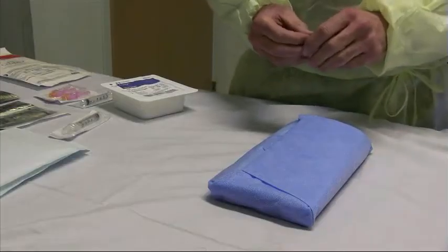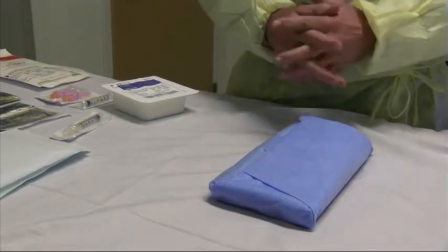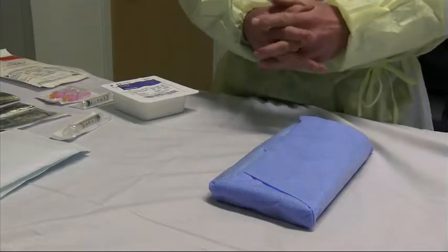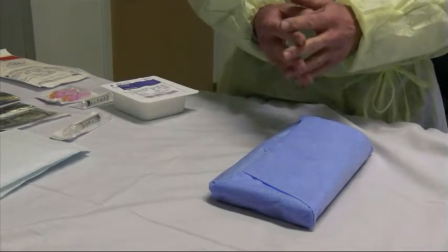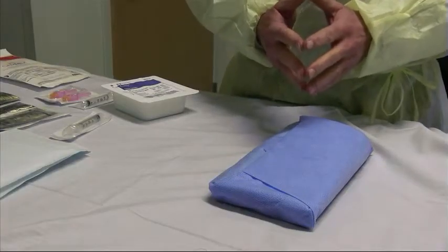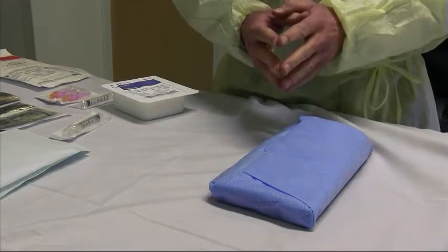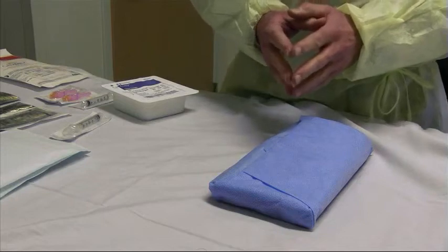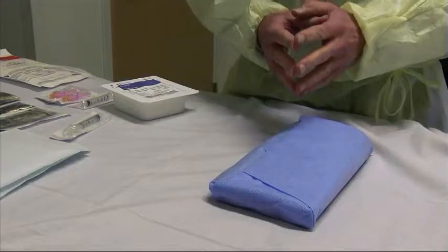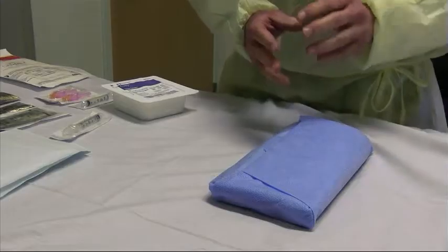The point of this video is to teach you how to perform fine needle aspirations or biopsies in the ultrasound department. We do it mainly on thyroid nodules, but you can apply these techniques to evaluating other masses such as in the liver, or really anywhere in the body — including paracentesis and thoracentesis. The advantages of doing fine needle aspiration or biopsies under ultrasound guidance is that we have real-time imaging, we don't need ionizing radiation, and the technique is also portable.